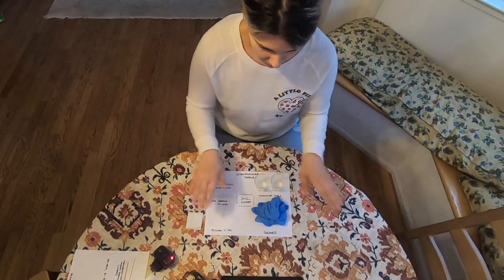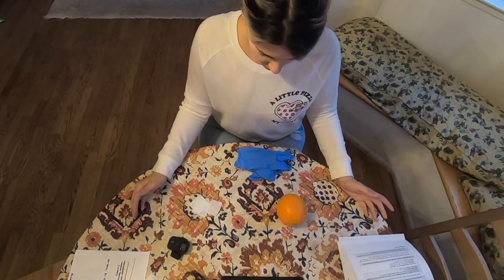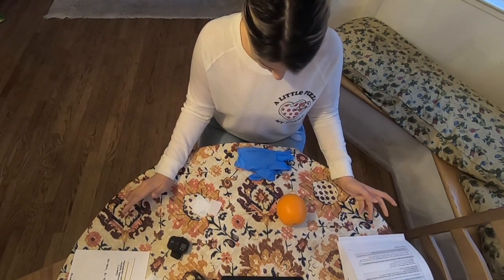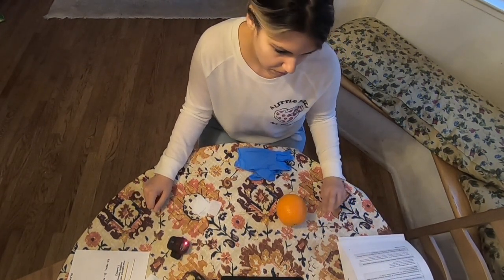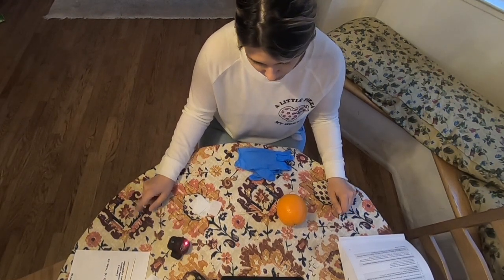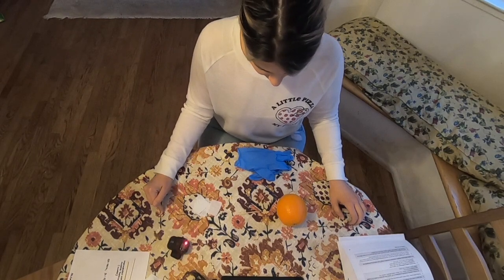Dispose of the materials and get ready to administer. We have entered our patient's room with our prepared syringe with the correct gauge, correct medication, and correct syringe. We have introduced ourselves to the patient, confirmed their identity using either their medical record number and date of birth or their name and date of birth. Allergies were asked and clarified. Everything is ready. Hand hygiene has been performed.